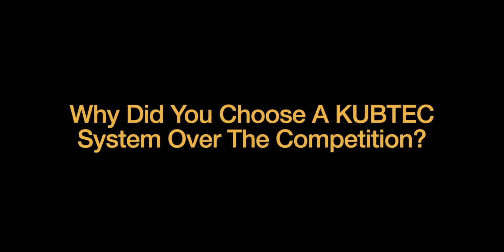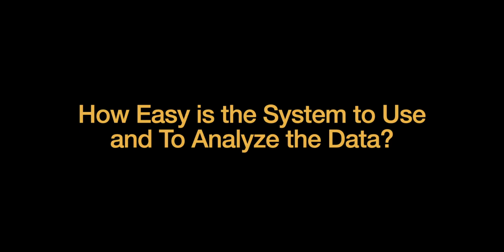So when we purchased our Kubtec system, it was in the goals of replacing a system that had gone down. In our original conversations, we had reached out to the manufacturer of that previous system and found Kubtec as well, and what really drove me to the Kubtec system was the quality of the customer service and the technical support. It felt at the time that Kubtec was both responsive to my questions and very detailed in their applications.